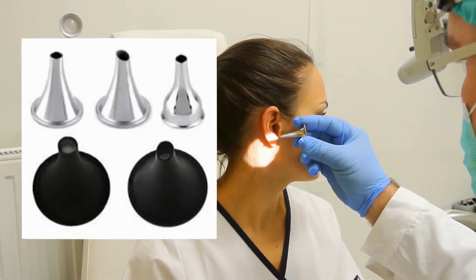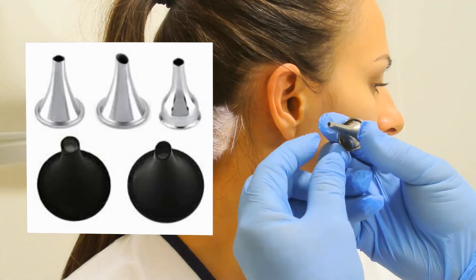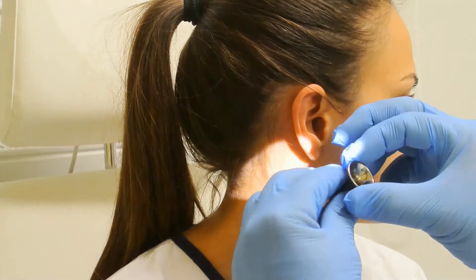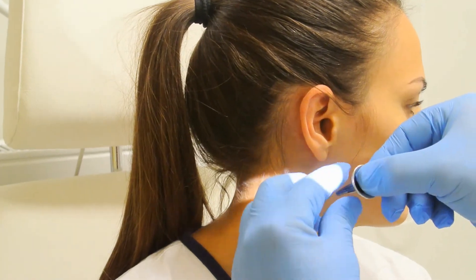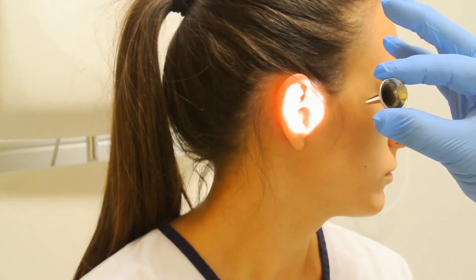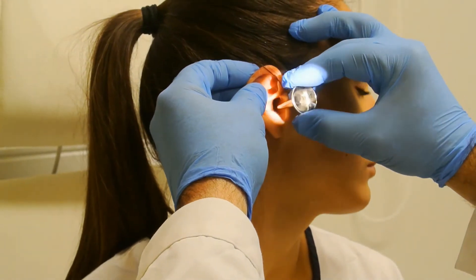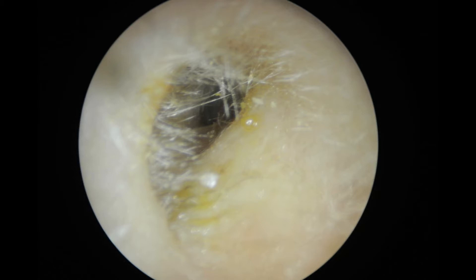To check the deeper part of the ear canal, we should use an ear funnel, either plastic or metal, which comes in different sizes. According to the size of the ear canal, we should choose the appropriate one. We should hold the rim of the funnel with our index finger and thumb, pull the tragus forward, and pull the auricle up and back.